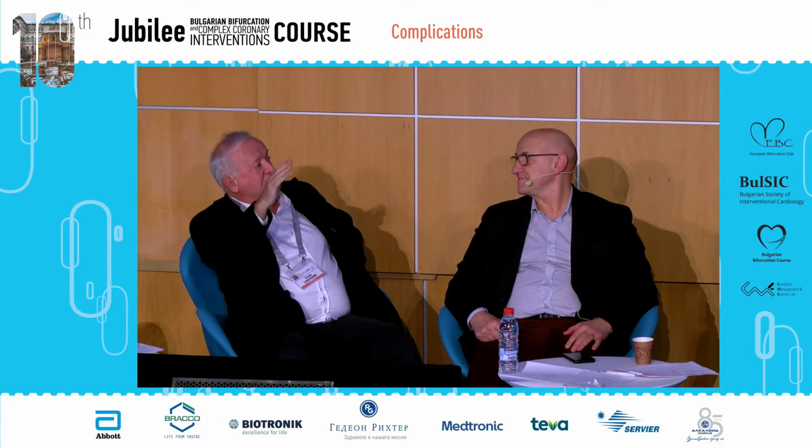We sought them from the right coronary, but you have not re-injected the coronary. That was just to say that maybe the situation of the circumflex was not as good as before, for sure. So now if you do a coronary angiography, maybe you will find collateral filling from the right. Just do a coronary angiography.